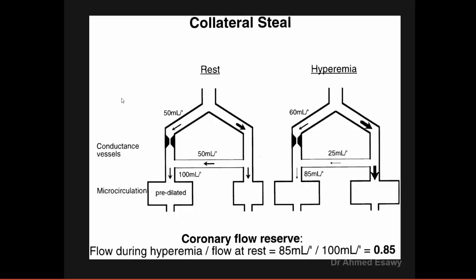Collateral steal, coronary flow reserve at rest or under hyperemia, demonstrating the mechanism of coronary steal syndrome.